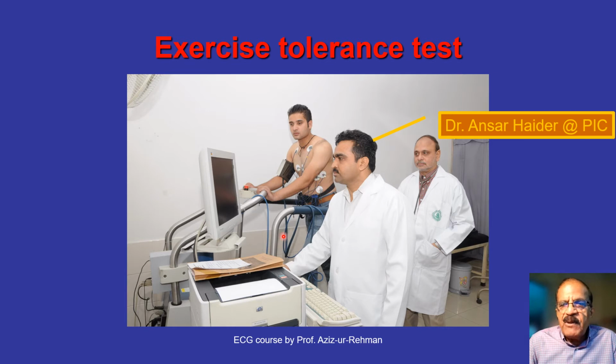if the patient develops chest pain and at the same time you see diagnostic ECG changes. In the resting state, there were no ECG changes, but if you see ST depression of at least 1 millimeter in at least two contiguous leads, and especially if the patient also feels chest discomfort at that time, the patient will be asked to stop the exercise and the test would be reported as positive for exercise-induced ischemia.